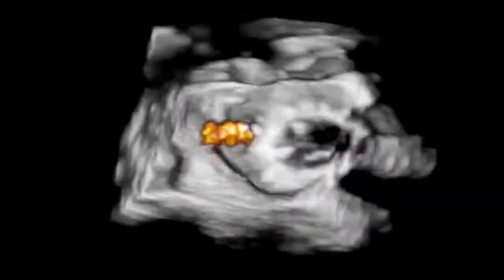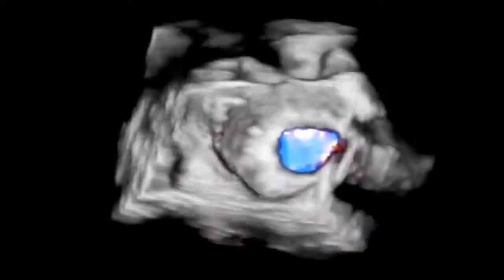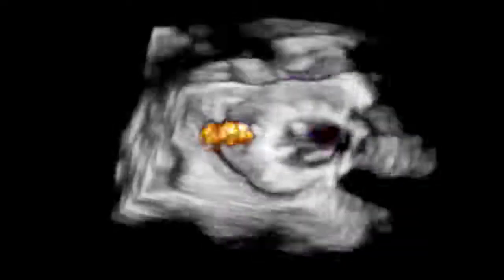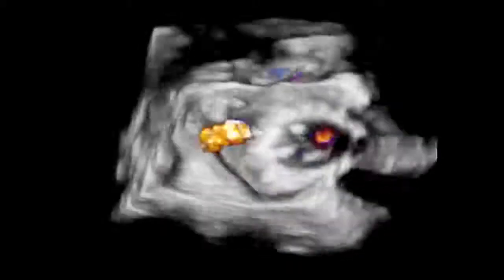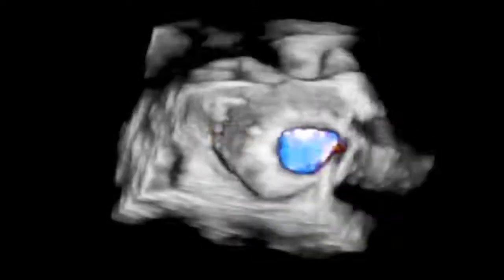Oftentimes, we're asked to determine the integrity of prosthetic and bioprosthetic valves. This image is a bioprosthetic mitral valve that has insufficiency or is leaking. On transthoracic views alone, it was difficult to determine the exact pathology or the pathophysiology of this valve. When applying the three-dimensional echo technique, one can certainly see that the regurgitation or the leak is coming outside of the annular plane, therefore making us suspicious for a paravalvular leak in this bioprosthetic mitral valve.